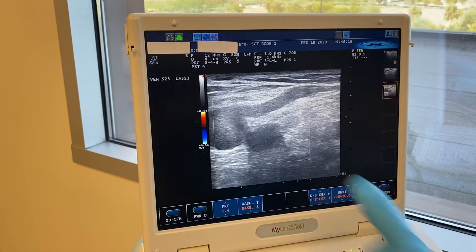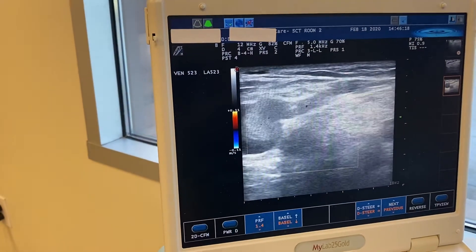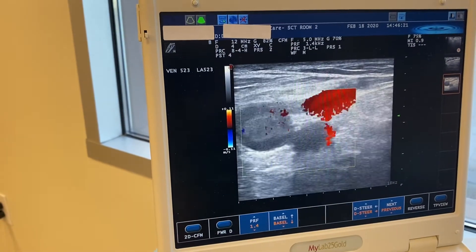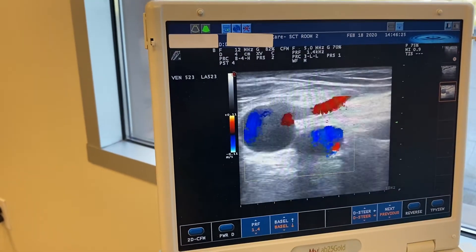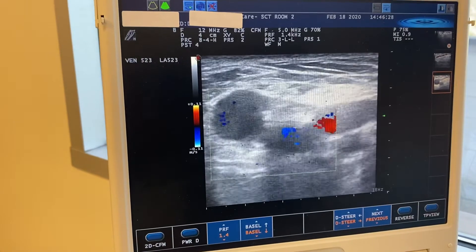I'll show you where the valve is broken — it's right here where you see the red when I compress. You'll see all this red coming out. It's a little hard to see on this side view, but it's actually this junction that's closed right here.